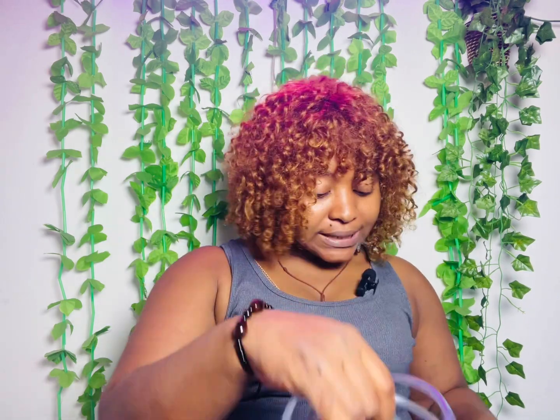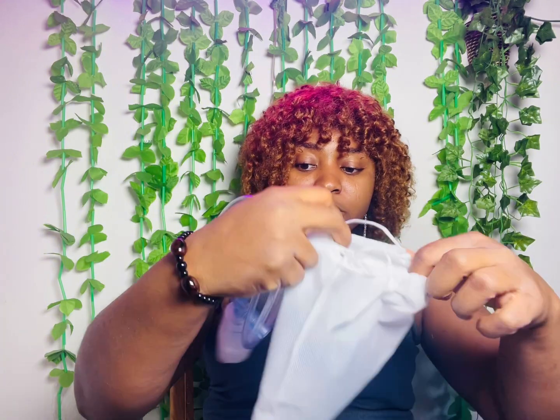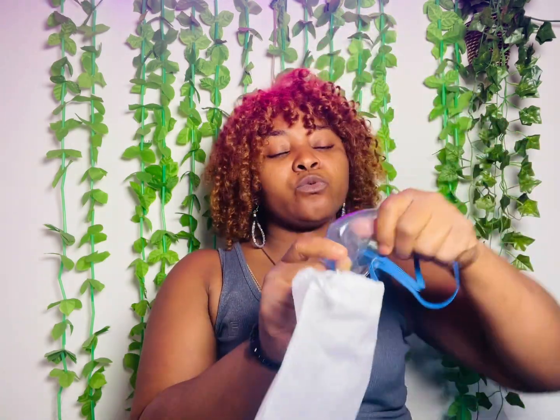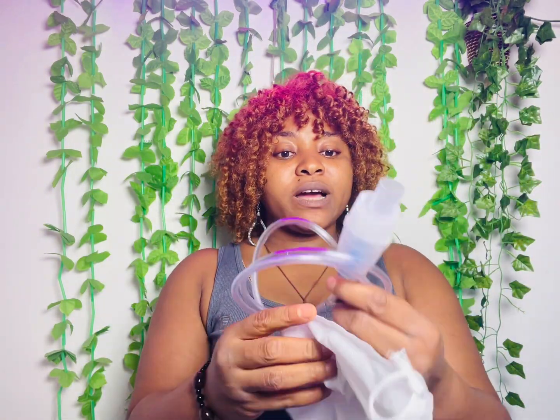Inside this product we have this tube, and we have this nose mask. It's supposed to be here. We have one for adults and one for kids as well. The first one is for kids, and this is for adults. Inside this product we have this too. I'm going to keep this one because I've shown you. And then we have this.